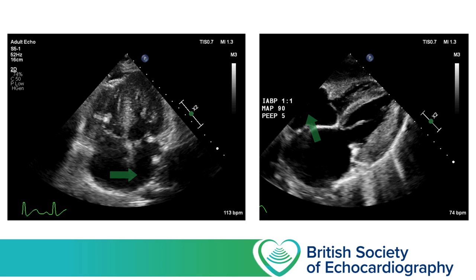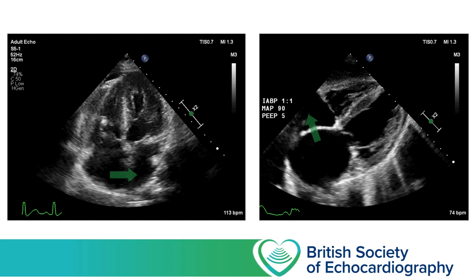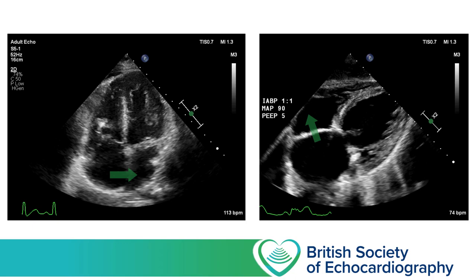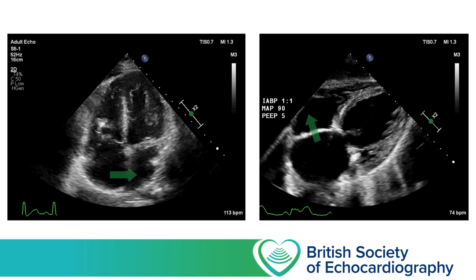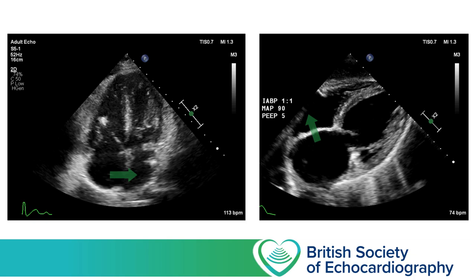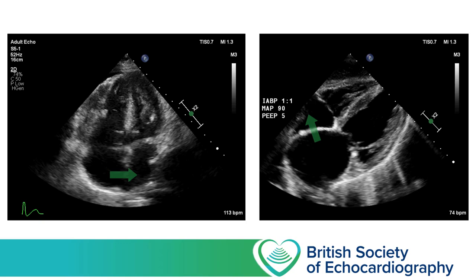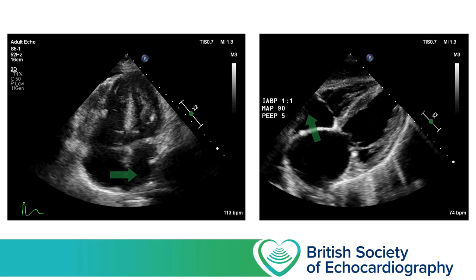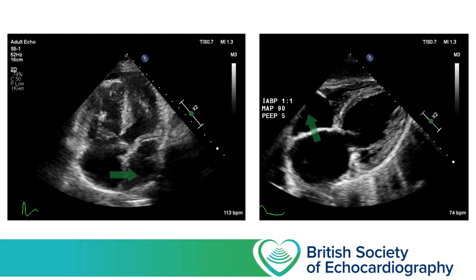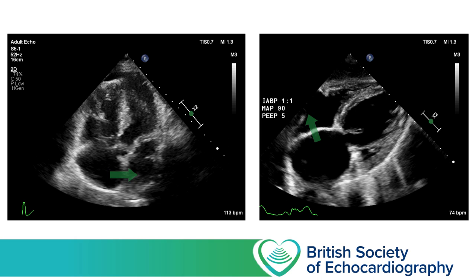Let's look at a couple of patients with pathology. On the left is a patient who had lower limb trauma, acutely deteriorated, and the echo provides clues as to why: the RV is dilated, function is impaired, the RA is dilated, and the intra-atrial septum is fixed and bowing from right to left. CTPA confirmed acute pulmonary embolus, and the particularly observant may notice a bright structure in the centre of the right ventricle, which in clinical context may well be thrombus. The patient on the right, by contrast, has bowing of the intra-atrial septum from left to right — this patient has a particularly high left atrial pressure due to acute pulmonary oedema from torrential MR, and made a good recovery following surgical mitral valve repair.